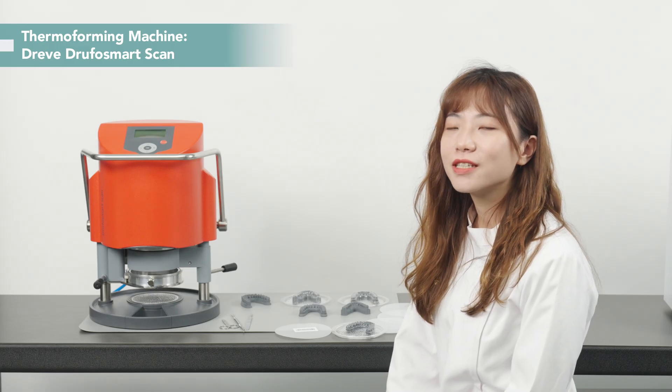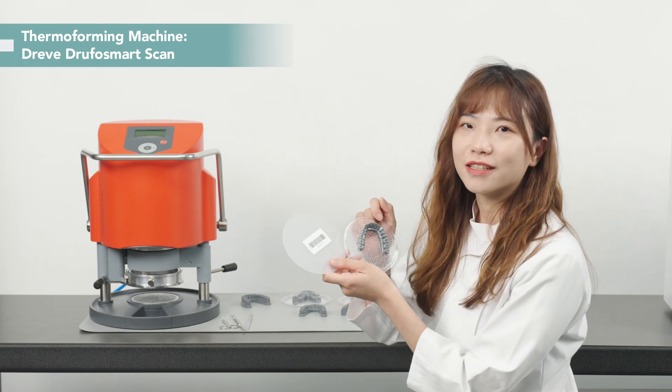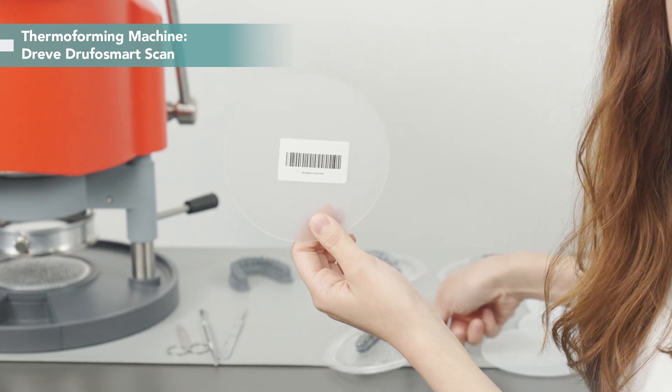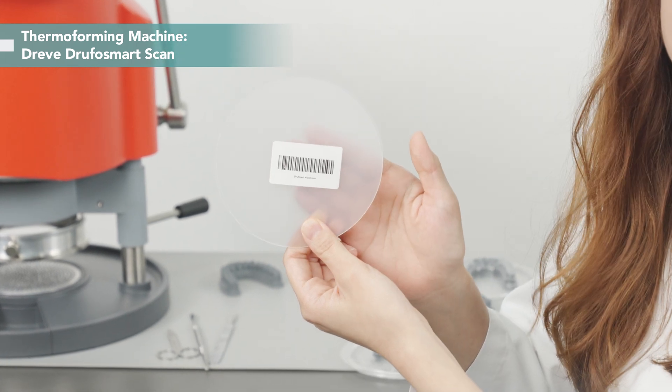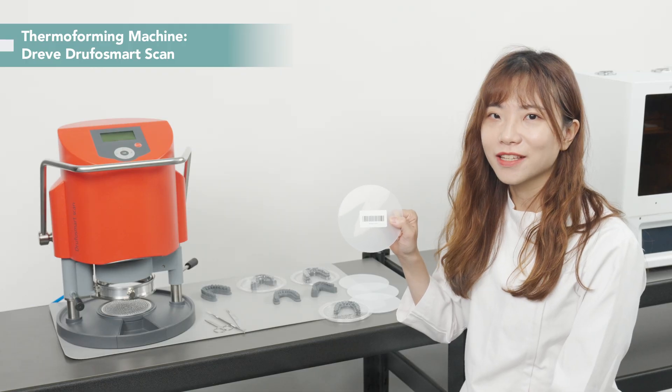We use the Dreve Drufosmart Scan today. This sheet will become our aligner. Each sheet has a different code, and with it, we can make the machine automatically apply the correct settings in seconds. That's why we love this unit.